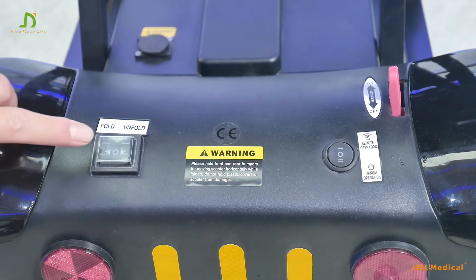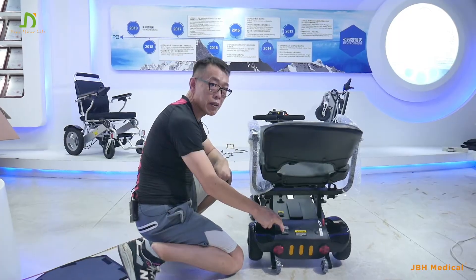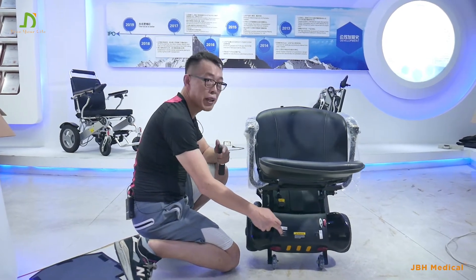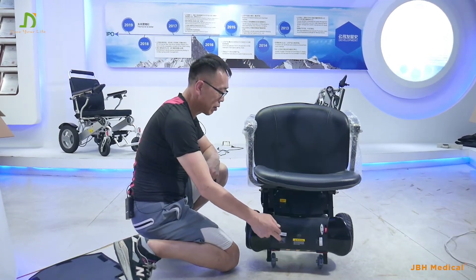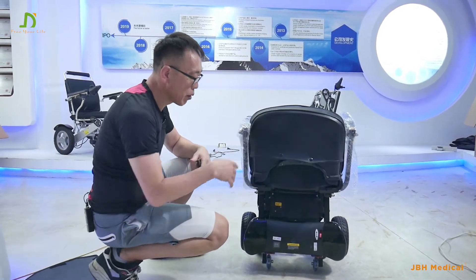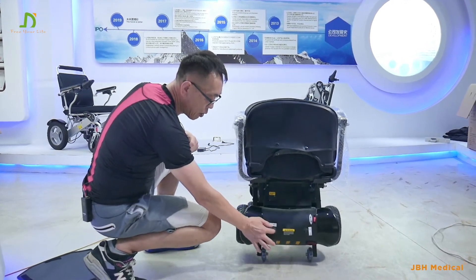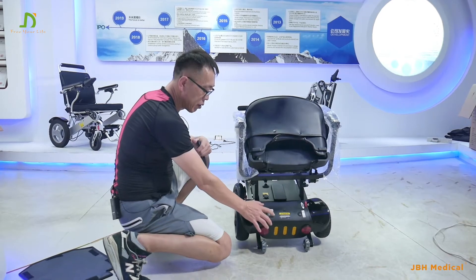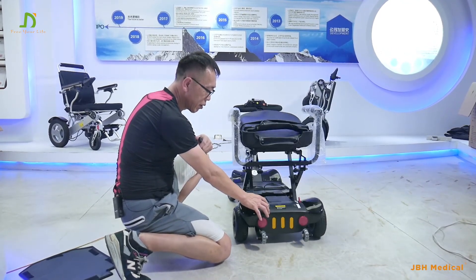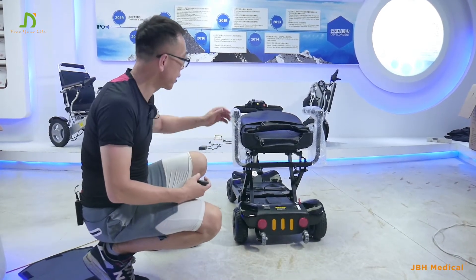Keep pressing the fold side of the switch and keep pressing until it's fully folded. Right now it's done. Then if we want to unfold it, press the other side of the switch until we hear the click sounds — the scooter is fully unfolded.